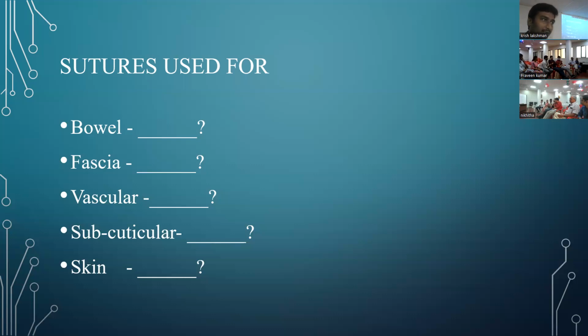Platelet adherence and distal embolization. Was asking for monofilament, polyfilament. Yeah. Fine needle, okay, round body. So what will you use here? You want absorbable or non-absorbable? Vascular, no, like I said, under tension. So you need it for a long period of time. Okay. Yeah. Next, subcuticular suture.